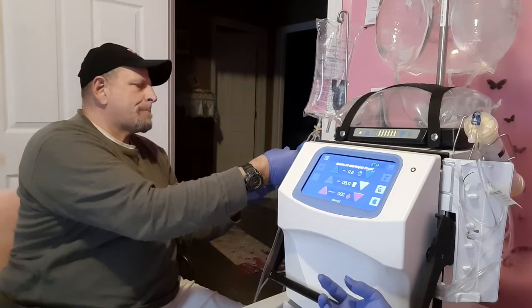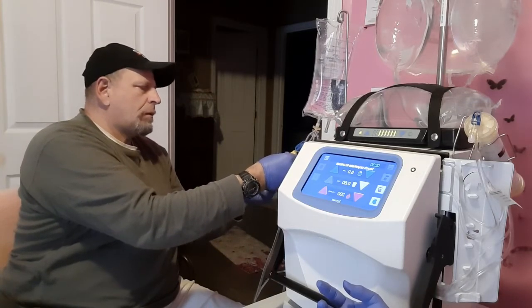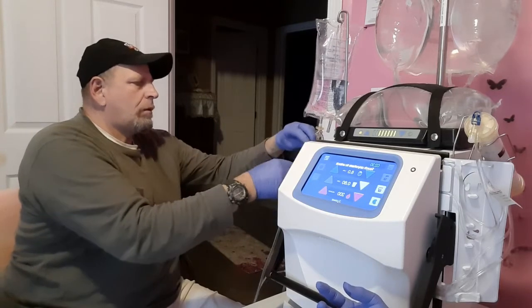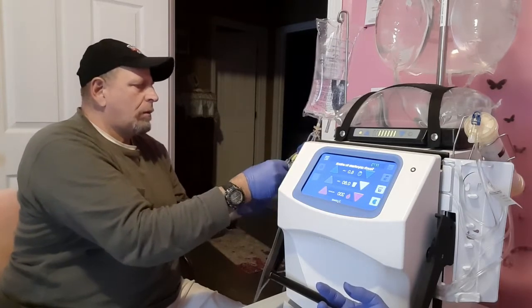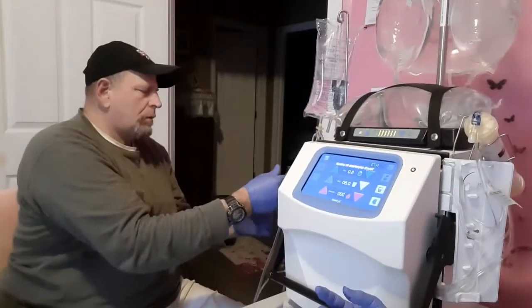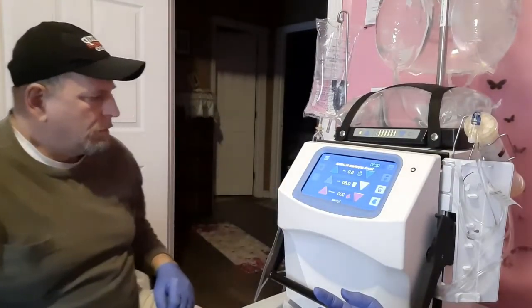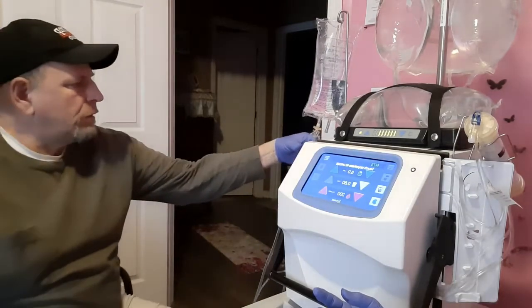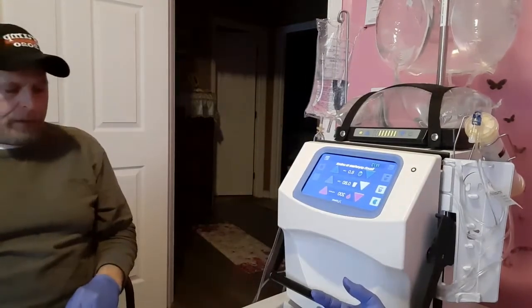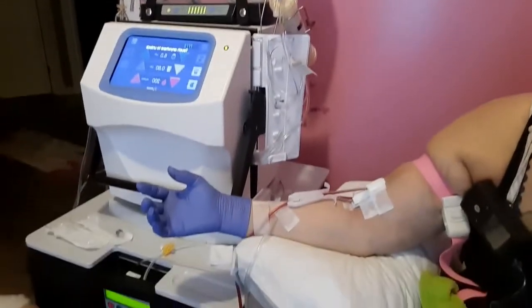And he's going to connect it to the venous. And then he's going to unclamp the top blue clamp, and he's going to draw 10 milliliters just in case. So 10 milliliters. He's going to draw that down. He has to clamp the top, and he leaves the syringe in there. Now we're going to move on to the arterial, and we're going to do the same thing.